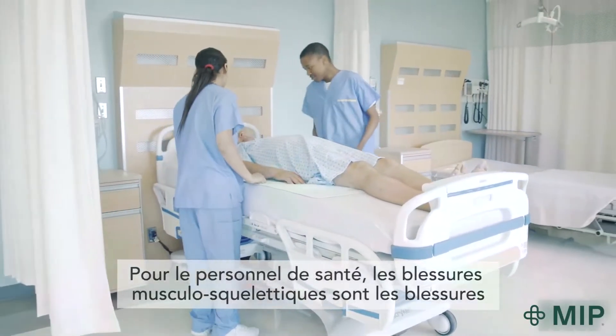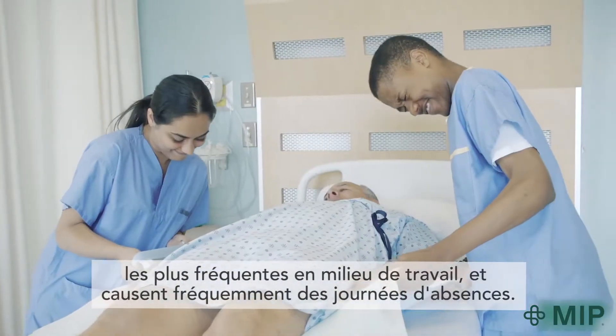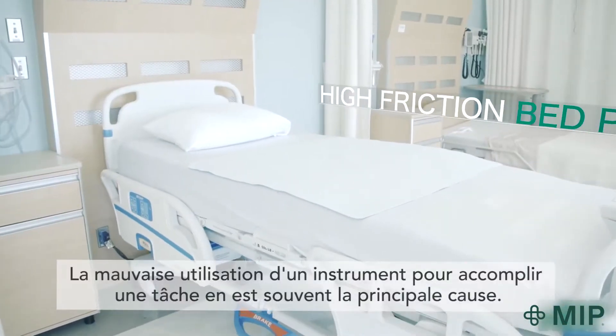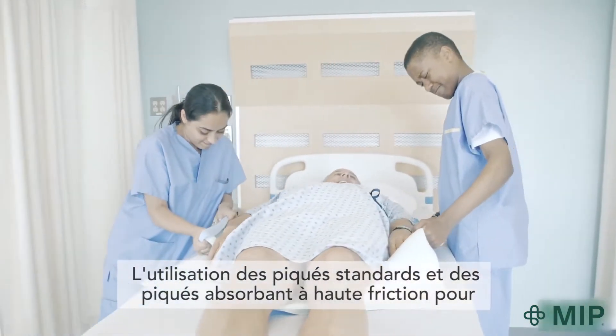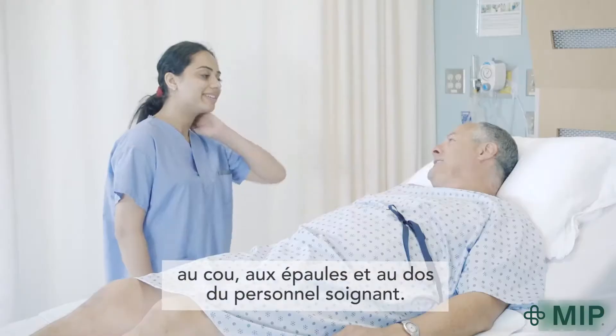Musculoskeletal injuries while repositioning patients or residents are one of the most frequent causes of missed workdays for healthcare workers. Having no tool or the wrong tool for the job is often the main contributing factor. Using high friction bed pads for moving patients or residents can mean frequent neck, shoulder and back injuries for caregivers.